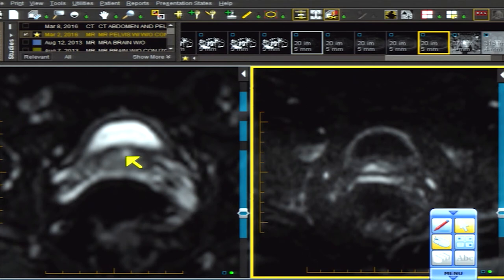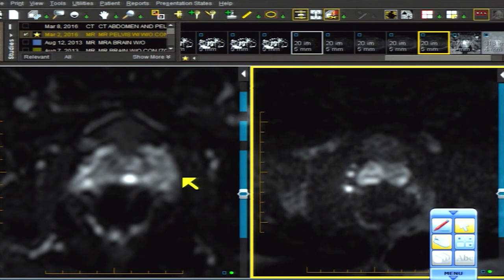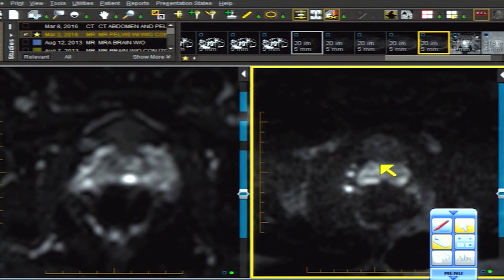As B values go up from zero to 1600 the restricted region gets progressively brighter. The utricular cyst goes away on B 1600 because fluid is sloshing around — it's not diffusion restricted. But the whole right side of the gland is diffusion restricted; you can only see it at B 1600, not at B zero.